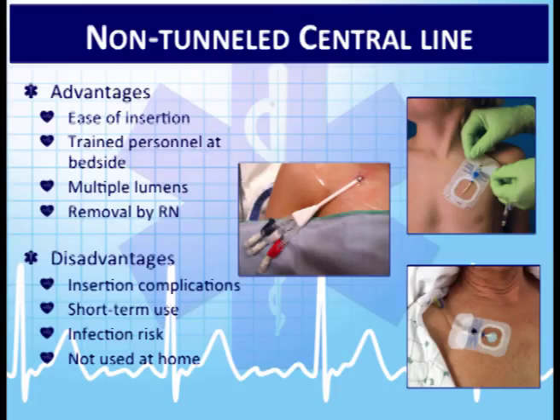I've learned in EMS, never say never. Usually these are assessed daily to see if they can come out, get them out as quickly as they can. Again, all of those sites look really nice. The dressings are clean, they're intact. The sites look good, there's not redness. There's caps on them, we like that.